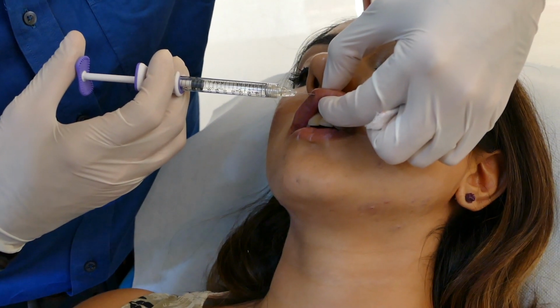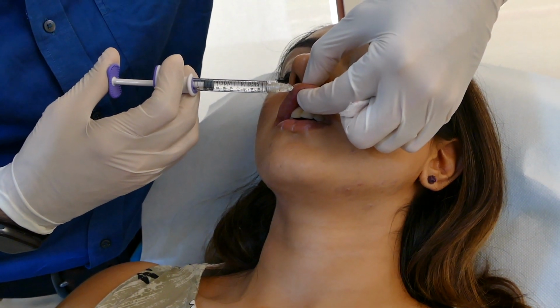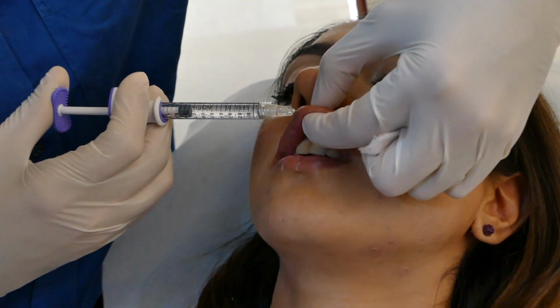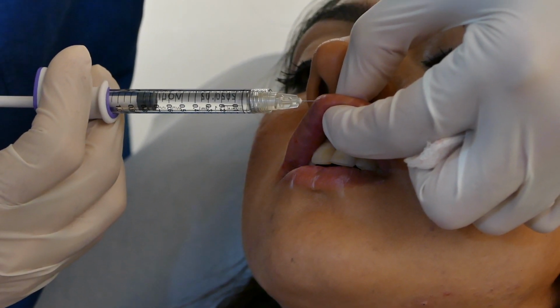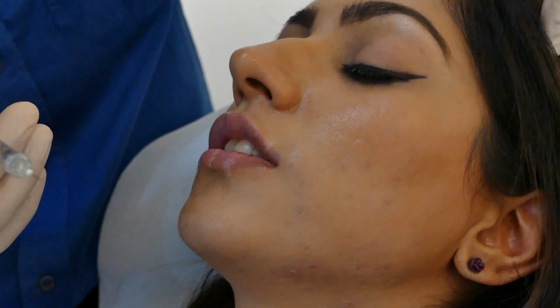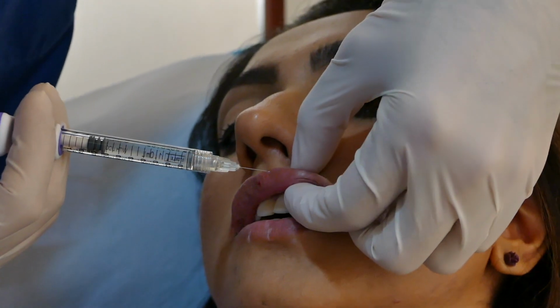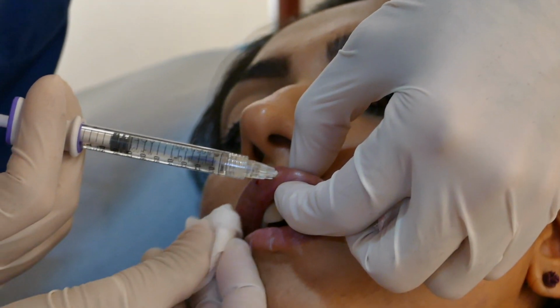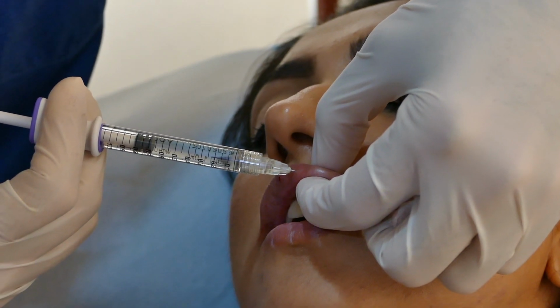Now he is injecting on the other side, on the left side of the lip, the middle third, about 0.1 ml intramuscular injection. Gentle needle introduction, gentle injection. And then he is injecting the lateral part of the left side of the lip. So far he has injected about 0.4 ml in the upper lip.